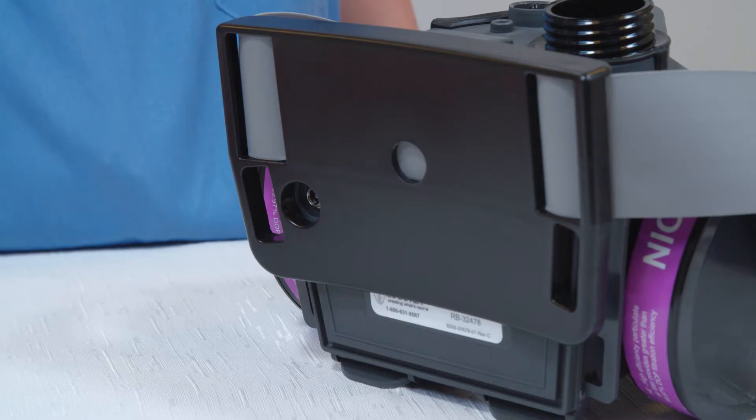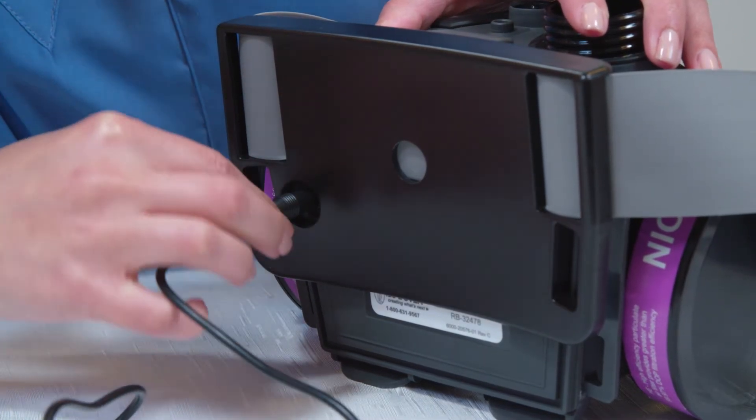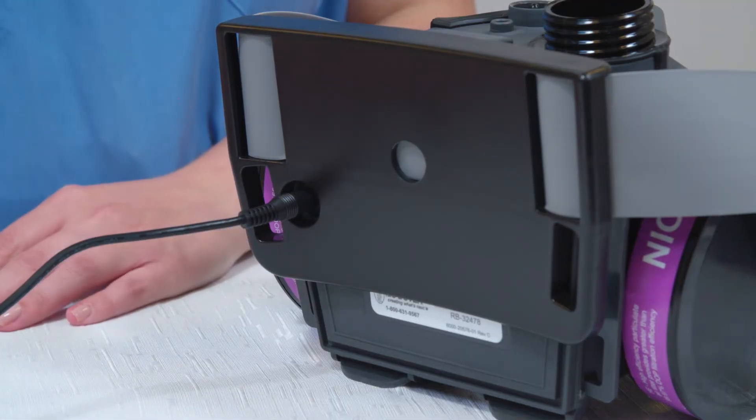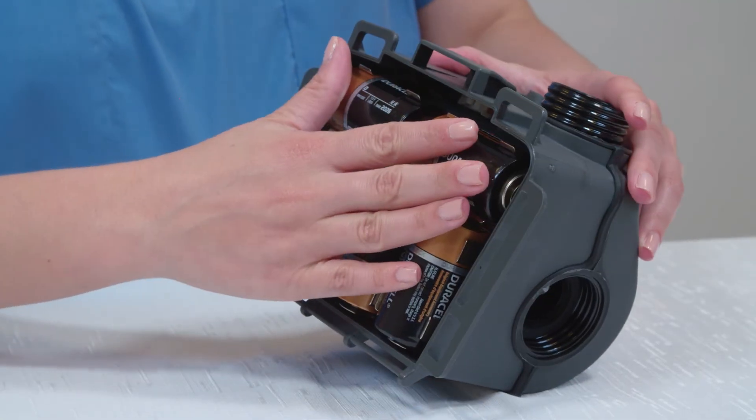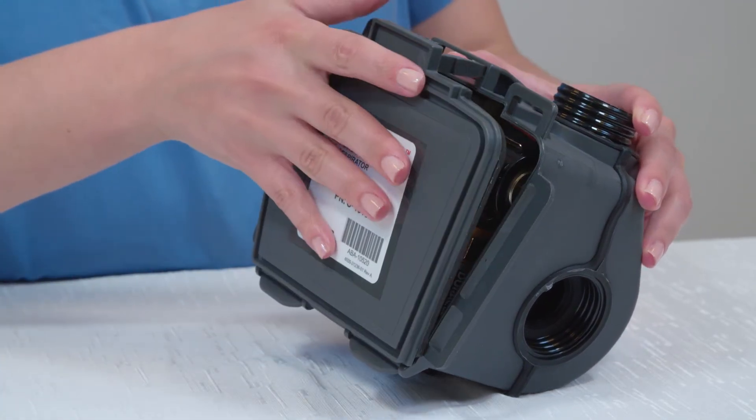The rechargeable battery can be easily charged by inserting the charge cable into the charge port, even when the blower is attached to the belt. The blower is also compatible with our unique alkaline battery pack, which can be easily installed instead of the standard battery pack.